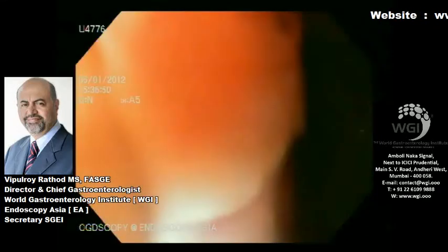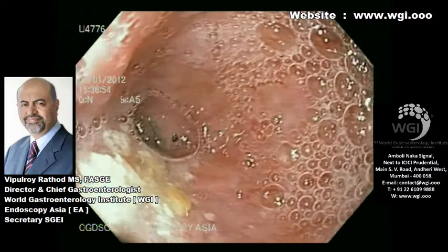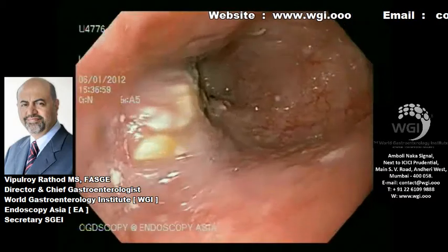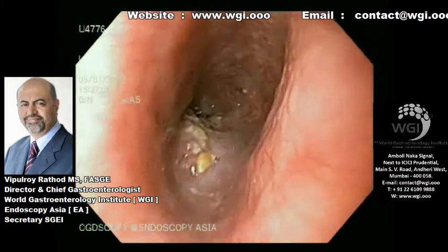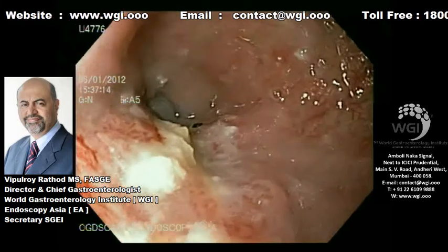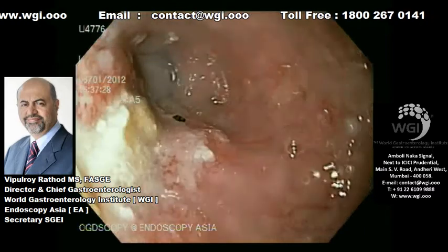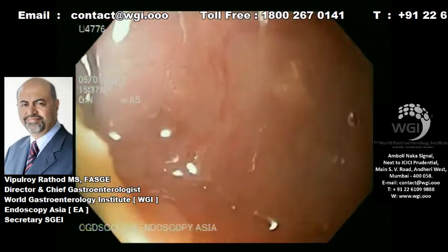A 66-year-old gentleman was referred to us for endoscopic palliation of a metastatic neoplastic lesion in the upper third of the esophagus. You can see here an ulcerous stenotic lesion. The patient came to us primarily with absolute dysphagia — he was not even able to swallow water. You can see there is hardly any opening seen in this case.